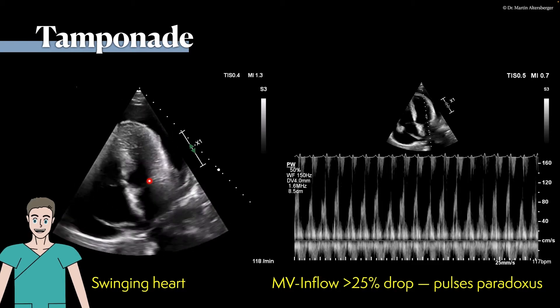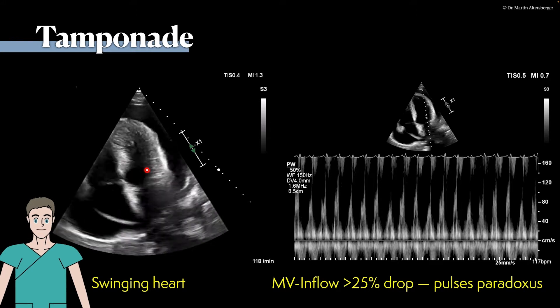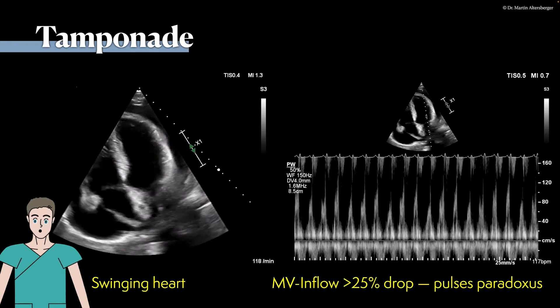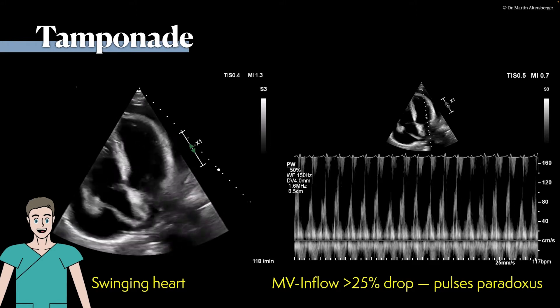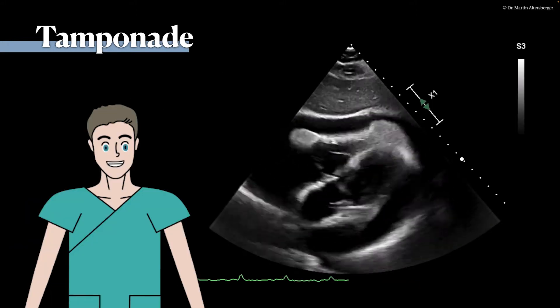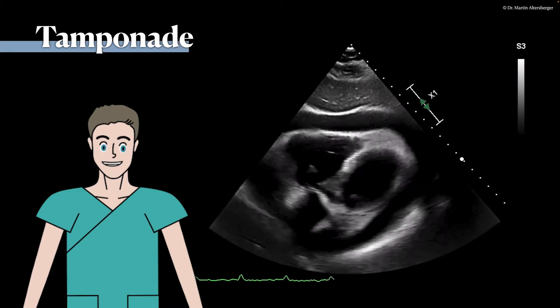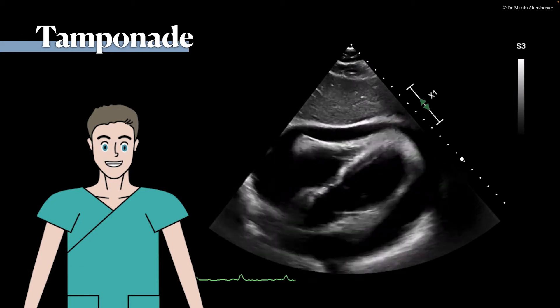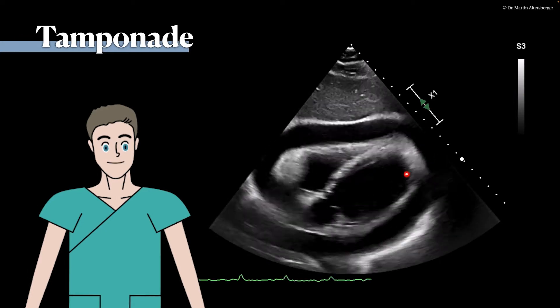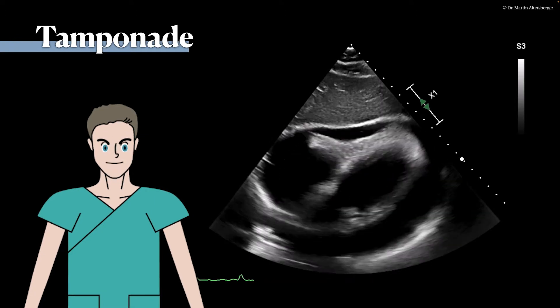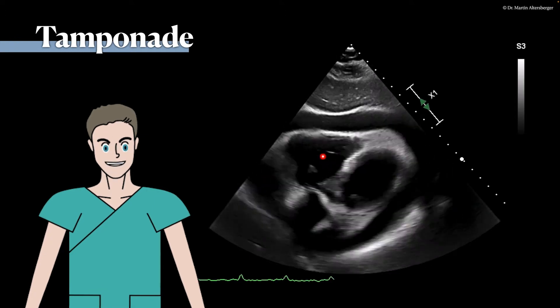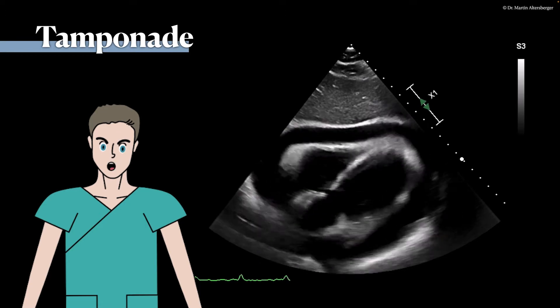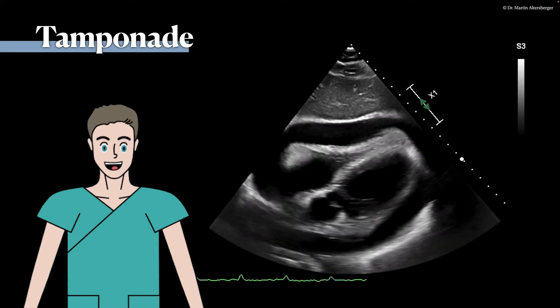Be aware that when you look at the swinging heart and place the pulsed-wave Doppler in the region of the mitral valve, sometimes you might lose the optimal position, so this sign has to be interpreted with caution. Moving on to a subcostal view: the subcostal four-chamber view is the view to evaluate pericardial effusion and tamponade. In this case, we see a moderate to large-sized pericardial effusion, and the right ventricle definitely cannot fully dilate during diastole — so this is echocardiographic tamponade.